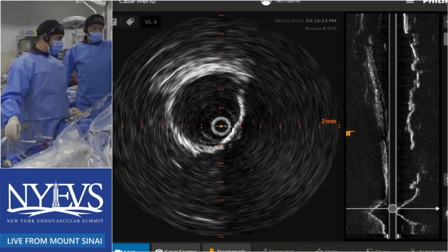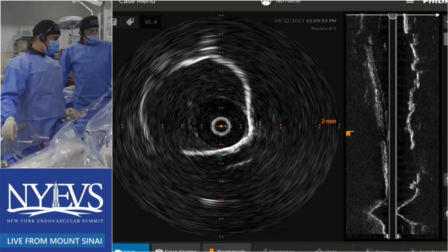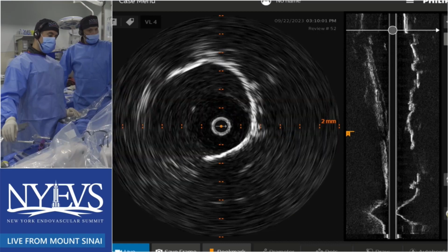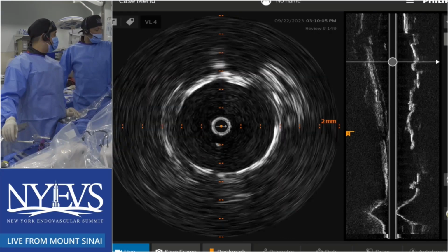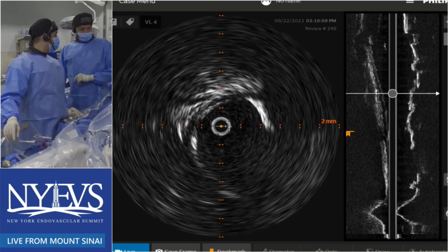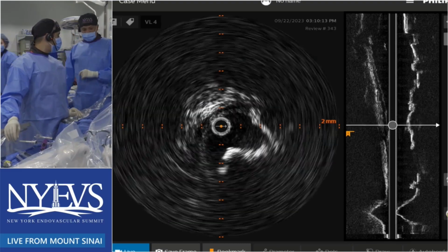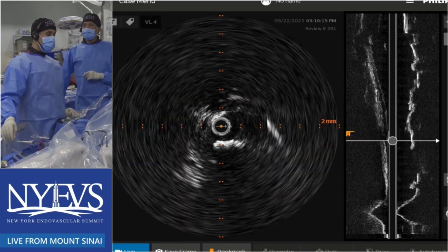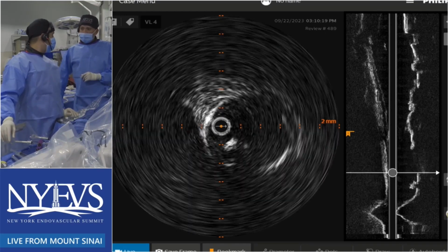That drove, there's further separation later on, but I think early on you need to be comfortable that you can dilate it to an adequate size and that you're getting adequate expansion with what you do. But I have to admit, after COBEST I was using covered stents more than I am now. I've kind of gone back to using a lot of uncovered stents because I think they work pretty well.